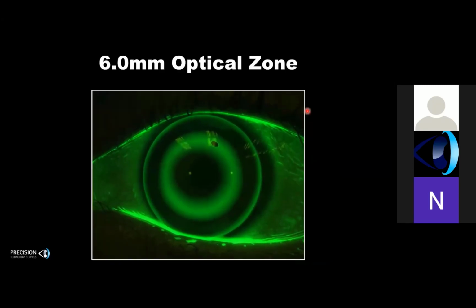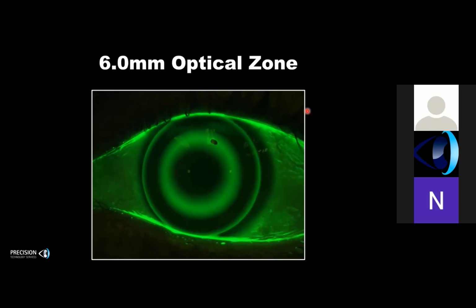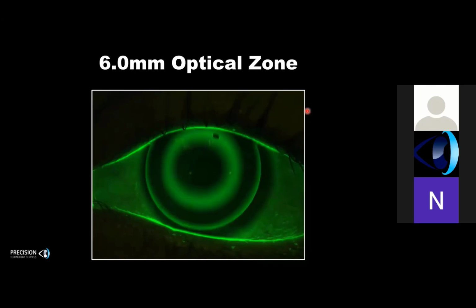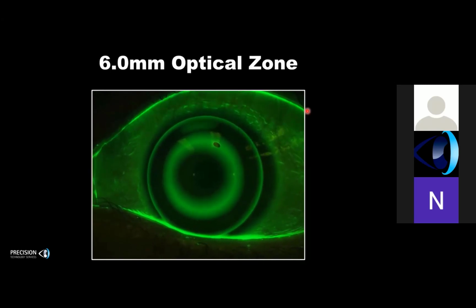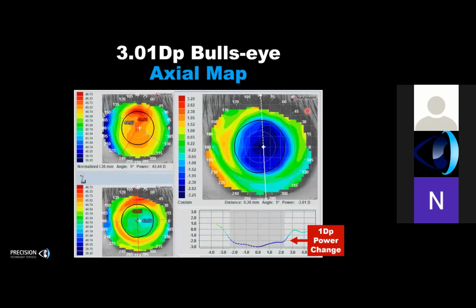Now, here's a standard 6mm optic zone lens. This is kind of what you would say dominates the industry in most brands of lenses. Now, what do we expect when we place this lens on a patient for myopia control, as an example? So let's take a conventional adult-oriented lens, put it on a child. And here we have an outcome where the Ortho-K effect has created 3 diopters, 3.01 diopters effect.